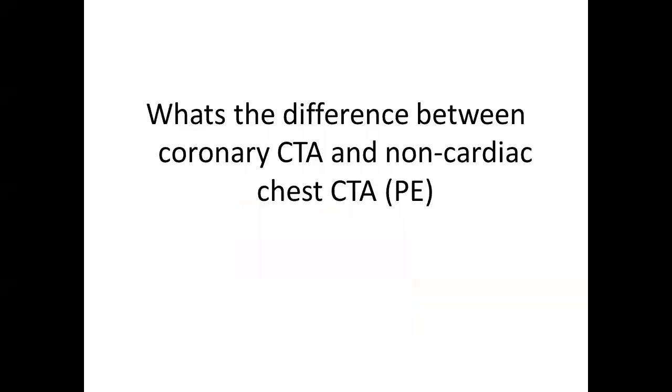Okay, so I think this really is the most important thing. What's the difference between a coronary CTA and a non-cardiac chest CT like PE? And Kashan, you're not allowed to answer. And Bill, neither you. Gating, okay. So coronary CT is gated, and we'll talk about what gating means. Whereas a chest, like a PE, is not gated.